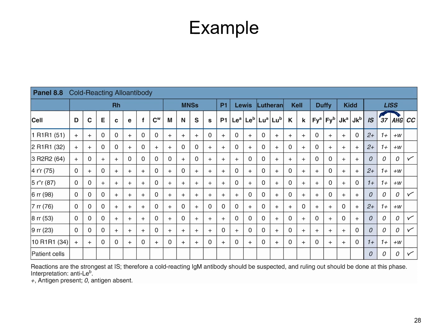This particular case, they said it's a Lewis B. We'll take a look here and see where Lewis B is. Yes, you can see that your reactivity is taking place with all of those Lewis B. We could go through and do this rule-out process, but that's just going to make this PowerPoint longer.